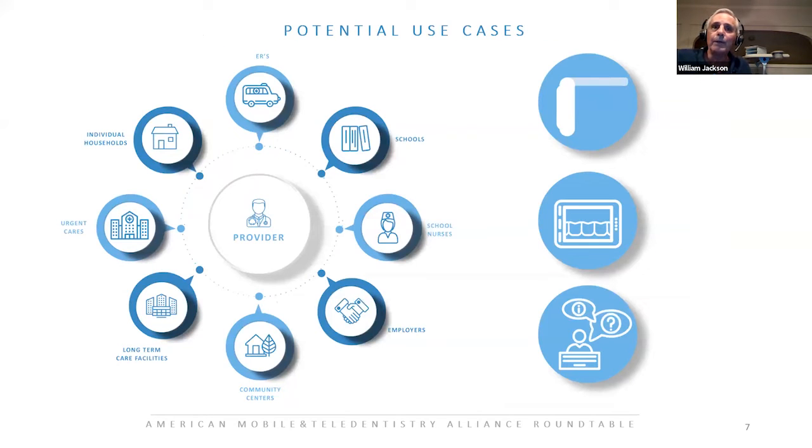So as I mentioned, we keep coming up with different ways that this might be used. Certainly it's going to be used on the professional level, and the professional level can extend beyond just a hygienist or a dentist using this to illuminate the mouth and gather images, whether they be real time or just photos. But we see the value, and we're already talking to emergency rooms, where health plans, Medicare Advantage primarily, want to keep their patients out of emergency rooms. So potentially they could have these at acute care centers, and a patient can go in there, or it could be done in a physician's office.